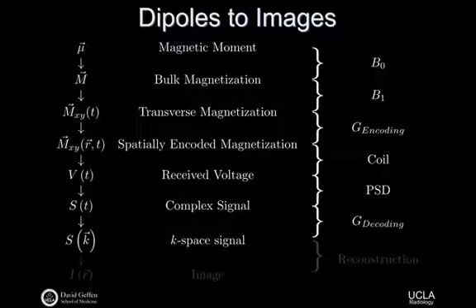We'll jump through a lot of this without getting into too much specifics about the gradient encoding and the gradient decoding itself. That'll come up more when we get to the spatial localization measures.